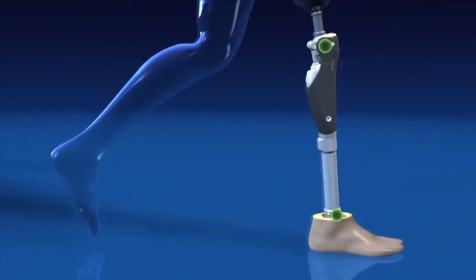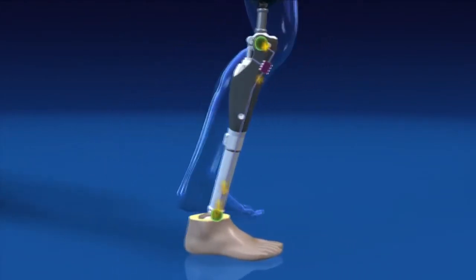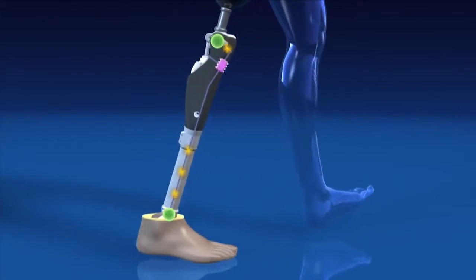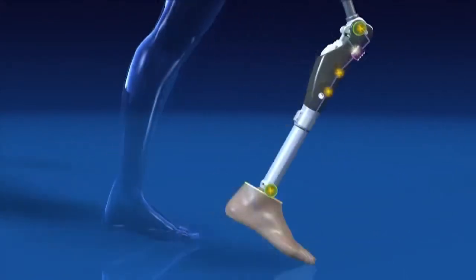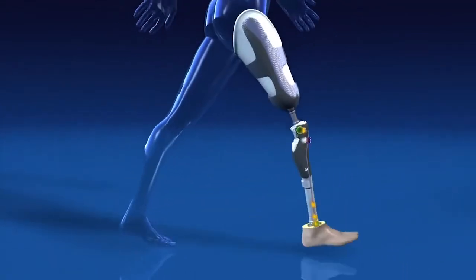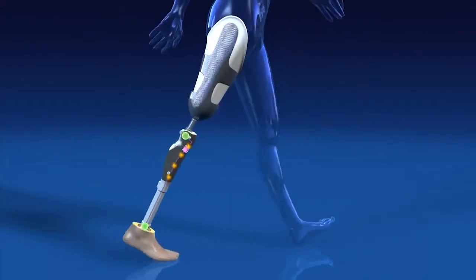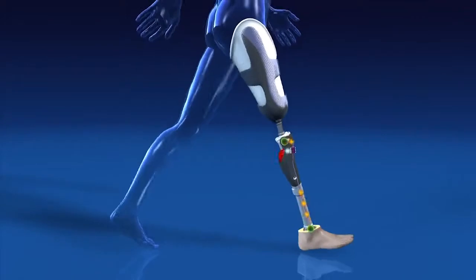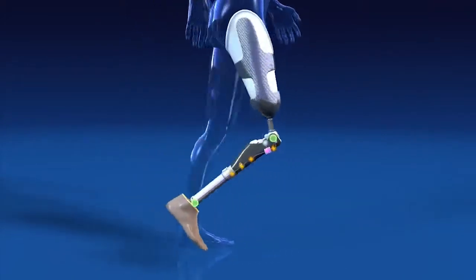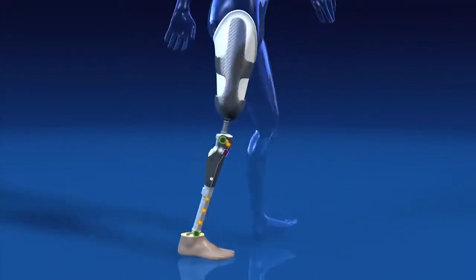Two sensors in the knee and ankle supply information to a microprocessor. Based on this information, the microprocessor controls the hydraulics in real time. The required operational energy is supplied by the integrated battery. In the Sea Leg, the sensors effectively replace some of the body's natural sensors and the hydraulics replace some of the stabilizing muscle functions.